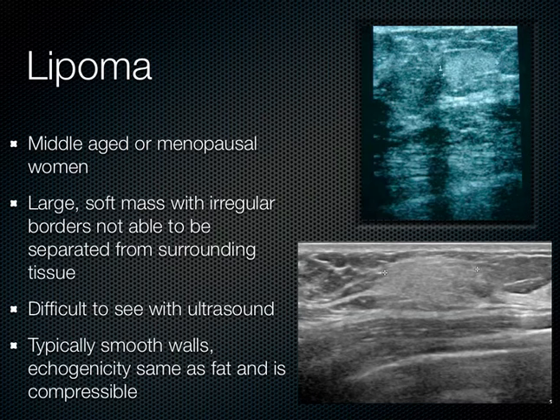Lipomas occur more often in menopausal or middle-aged women — large, soft masses with irregular borders that are difficult to separate from surrounding tissues. They're difficult to see on ultrasound because they have the same echogenicity as fat, so you have to really strain your eyes. They usually have smooth walls. When you compress them, they're easily compressible.